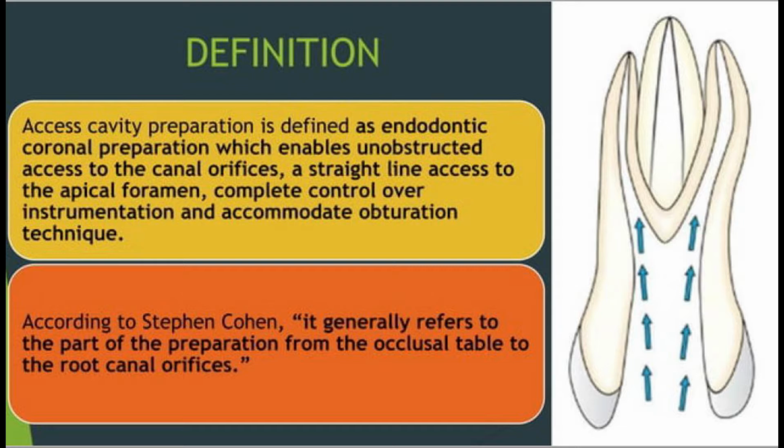Or, it is defined as endodontic coronal preparation that enables unobstructed access to the canal orifice, that is, a straight line access to the apical foramen, complete control over the instrumentation, and accommodation of the obturation technique.